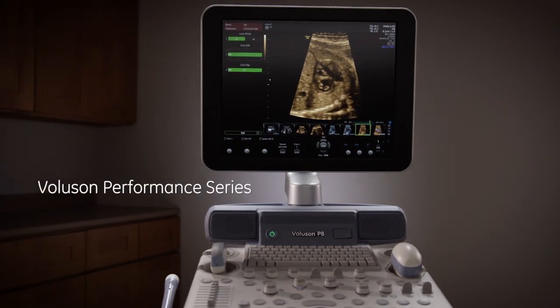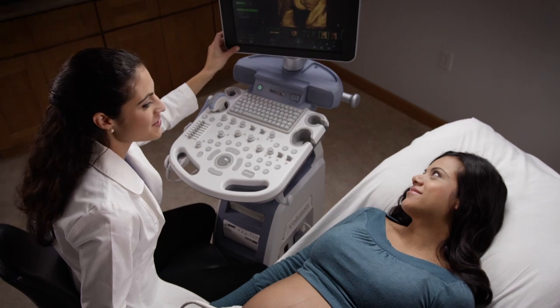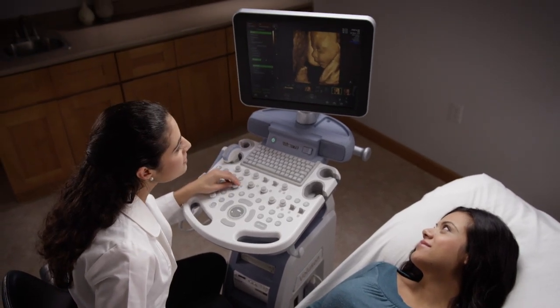The Voluson Performance Series is an easy-to-use system with excellent image quality and performance to help meet the daily needs of your practice.